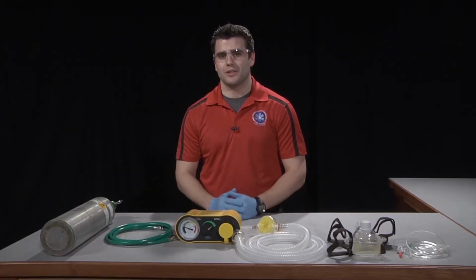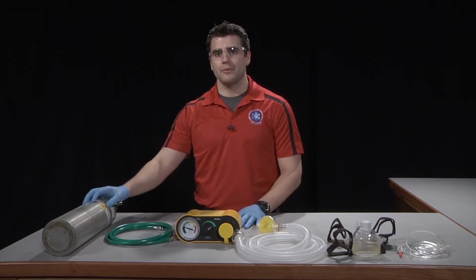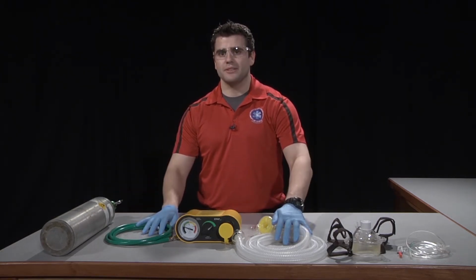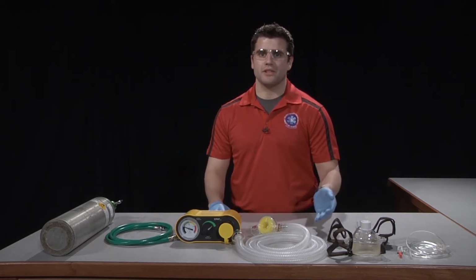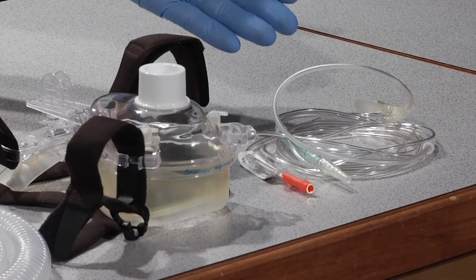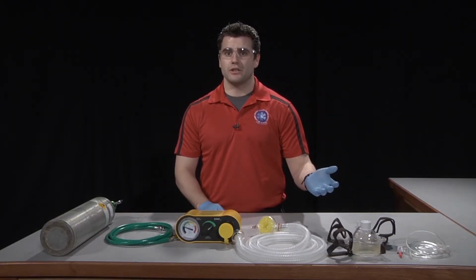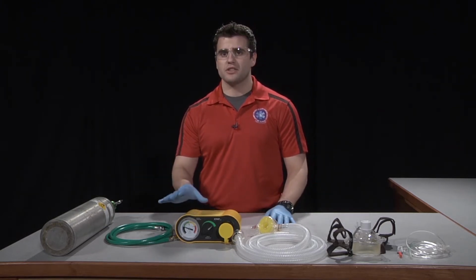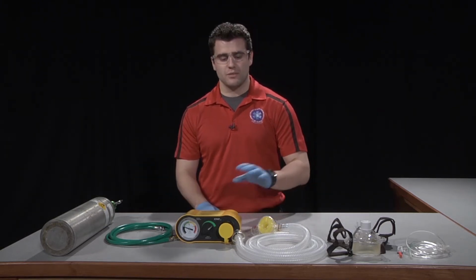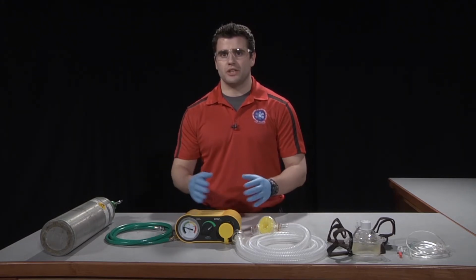Now we're going to gather and assemble our equipment for CPAP. The equipment that we'll need is an O2 supply, hoses and tubing, a CPAP machine, our CPAP mask with head straps, and our EtCO2 nasal cannula. From there, we're going to coach our patient on how to use the CPAP mask. We'll then attach our oxygen supply to the CPAP machine as well as the breathing portion to the CPAP machine, and then turn on the O2 in the machine.